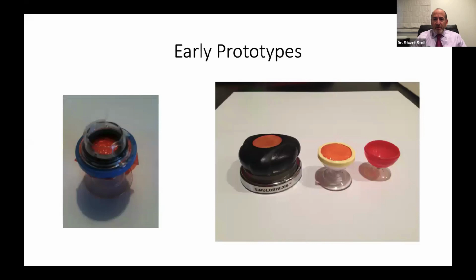Here are some early prototypes, and I think you can see my cursor. These little guys here on the side, I had a big revelation of using a suction cup for the bottom to help support the eye and allow eye movements.